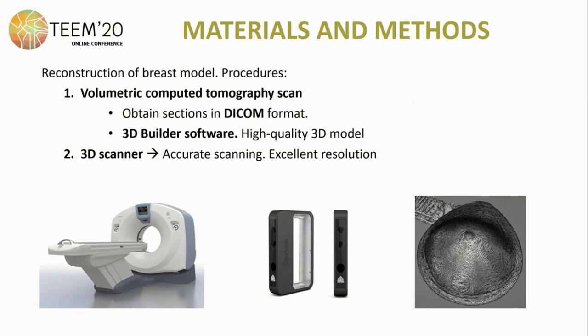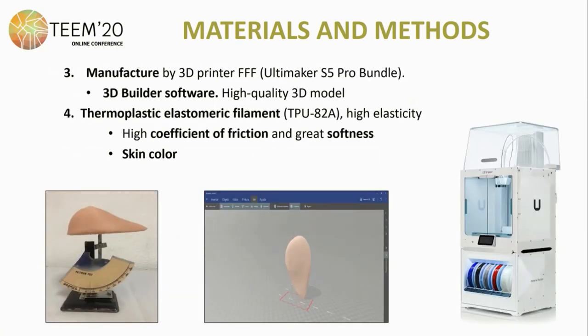For the reconstruction of the breast model, two types of procedures were carried out. First, a volumetric computed tomography scan of a standard prosthesis to obtain a mesh model which could be modified and adapted to the needs of the user — we obtained sections in DICOM format, then used 3D builder software to generate a high quality 3D model. We also used a 3D hand scanner that achieves very accurate scans with excellent resolution. To achieve the best quality of manufacture, we used the 3D printer Ultimaker S5 with efficient air filtration and filament humidity control, and the thermoplastic elastomeric filament with a high coefficient of friction and great softness, adding skin color similar to the patient.